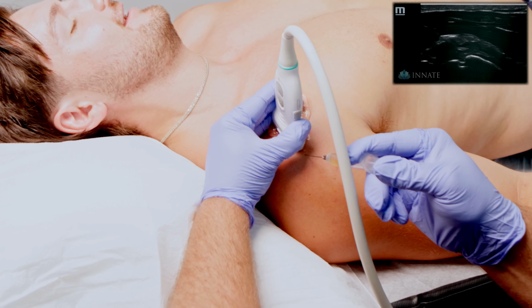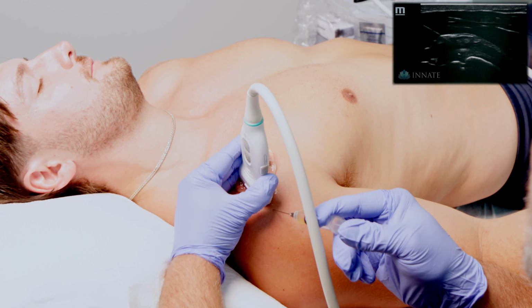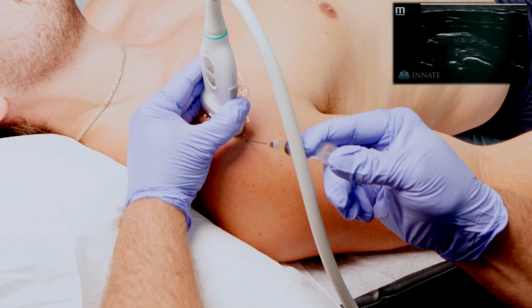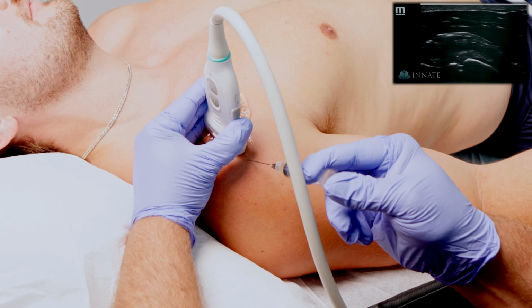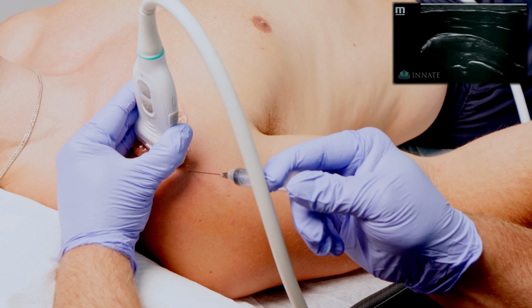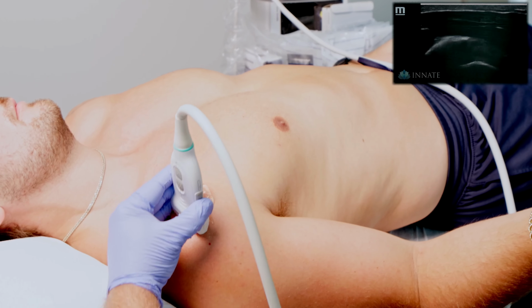Yeah, that's right. We could see right that focal area of change, and putting the rest of those cells here. You're going to be done in 5, 4, 3, 2, and 1. Needle's coming out. Perfect.